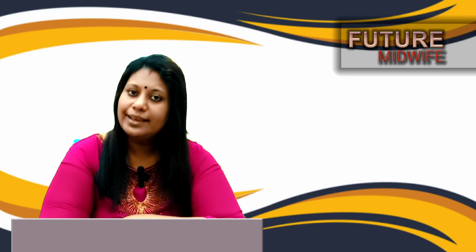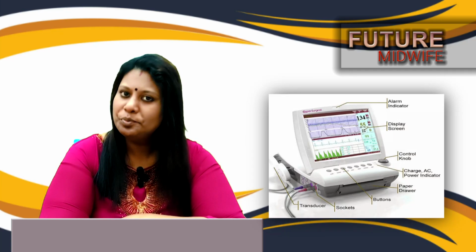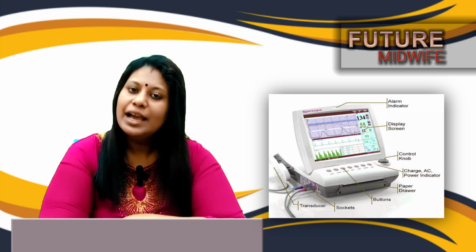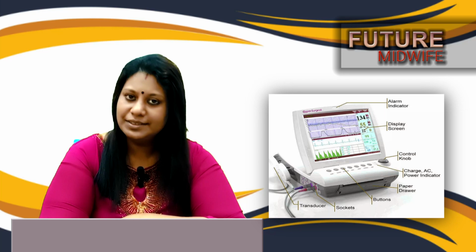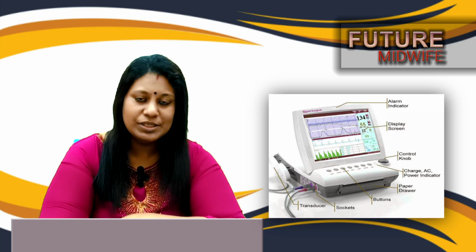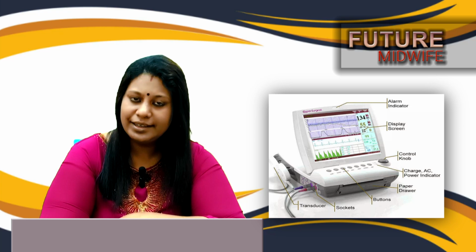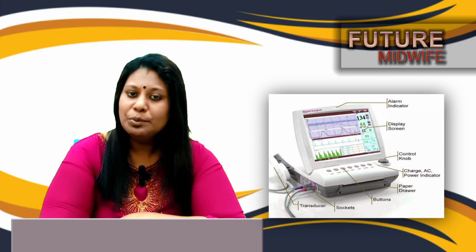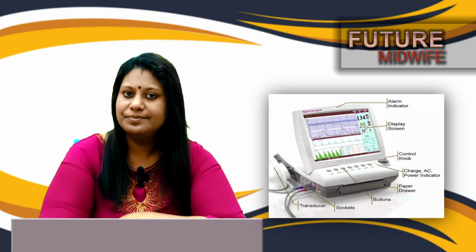Next, we'll discuss the equipment needed for NST. First of all, we need a non-stress test machine. Then a tray containing an abdominal belt, and a stethoscope to identify the fetal heart rate if necessary. Then we need jelly or a cotton pad, and graph paper. Apart from that, we need two transducers. The first one is the Doppler transducer to identify the fetal heart rate, and the other is the Toco transducer to identify fetal movement and uterine contraction. So these are the equipment used for NST.